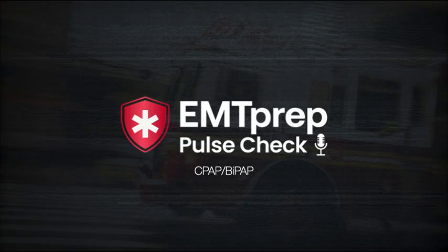Assisting ventilations with the BVM. So other devices that we use are going to be the positive end expiratory pressure valve, or PEEP valve. The PEEP valve increases pressure in the airways and allows for the alveoli to remain open even after exhalation. PEEP improves oxygenation by recruiting more alveoli to open and participate in gas exchange. PEEP is able to decrease pulmonary edema by shifting the fluid from the alveoli into the perivascular interstitial space, thereby improving oxygenation as well as ventilation efforts.